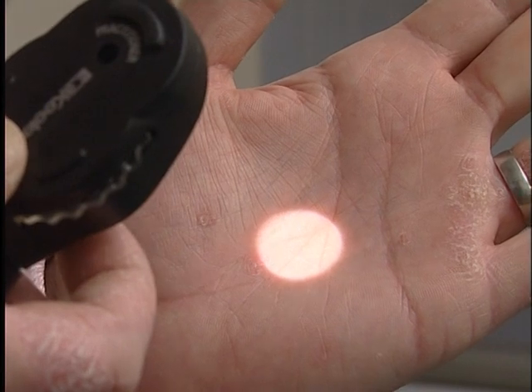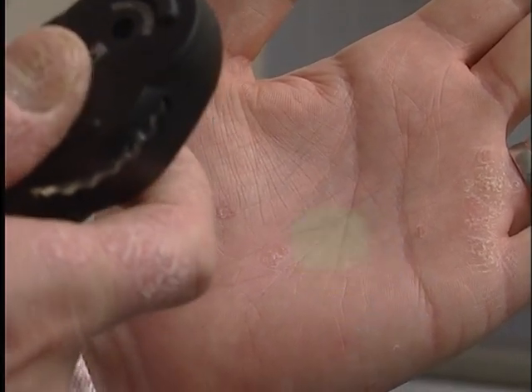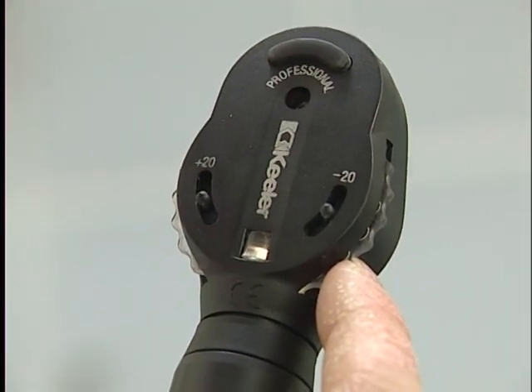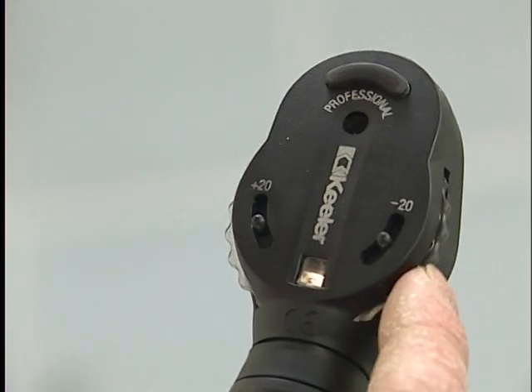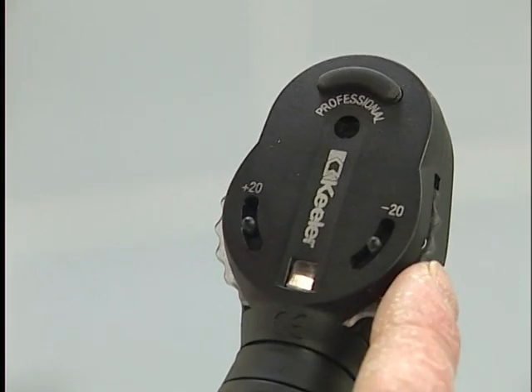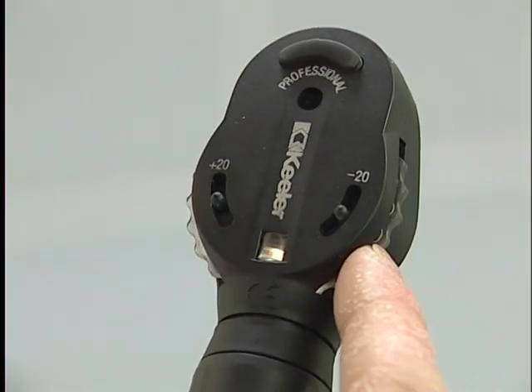The direct ophthalmoscope can be used to examine other structures within the eye rather than just the retina. This may be achieved by changing the diopter power to +8 diopters for the posterior lens capsule, approximately +12 diopters for the anterior lens capsule, and approximately 15 to 20 diopters for the cornea.